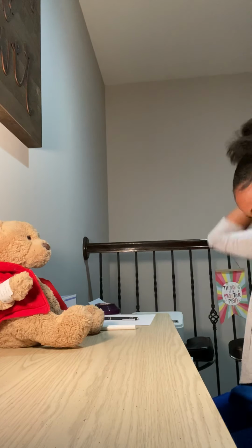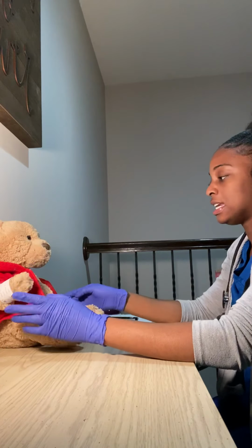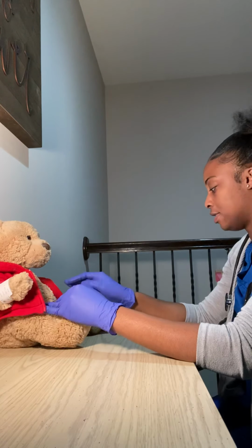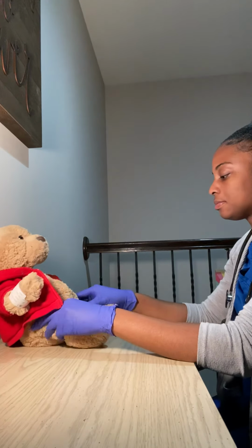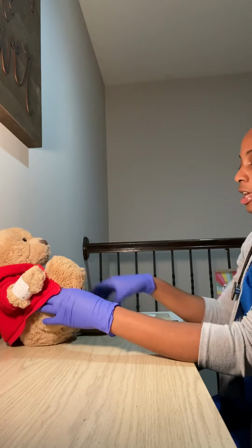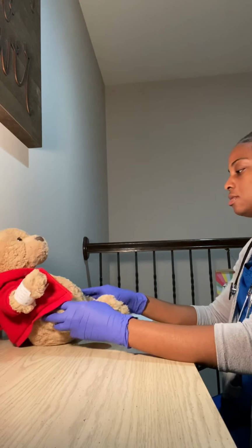Okay, so now I've listened to her lung sounds. Her pulse ox was 89%. She's having some labored breathing. Respiratory rate is at 32 again. So I know my patient's having some respiratory distress. I'm gonna move on down to the legs. Looking for any signs of edema. There's not. I'm gonna look at her heels to see if there's any pressure ulcer there. There aren't any, which is good.